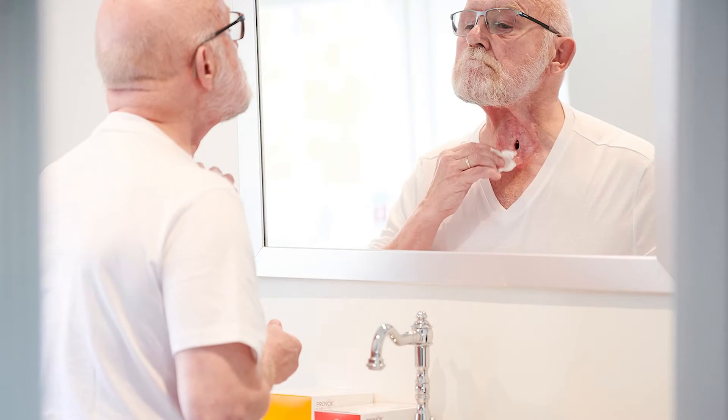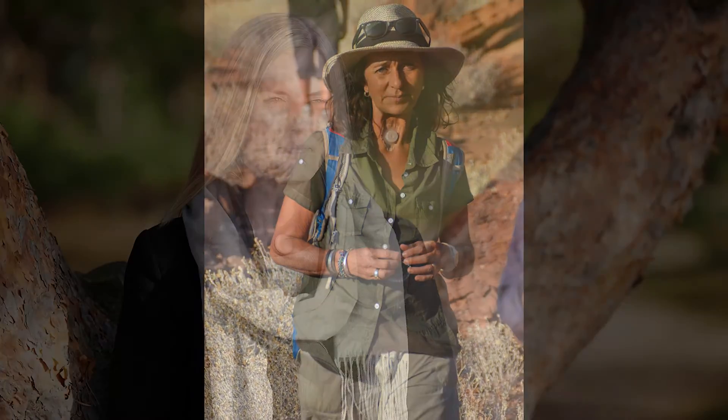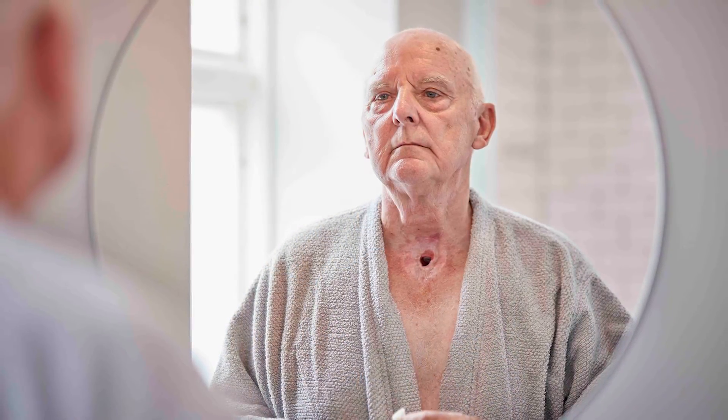For some people, the area around their stoma may be irregularly shaped or deeper set. Others live in a warmer climate where they sweat a lot, or they may live in colder climates and have drier skin. There are people who speak with a voice prosthesis frequently throughout the day, or even those who speak hands-free, which requires a stronger adhesion, and still others whose skin is recovering from surgery or radiotherapy. The reality is that everyone has different needs and different reasons why they may not be getting a good seal.